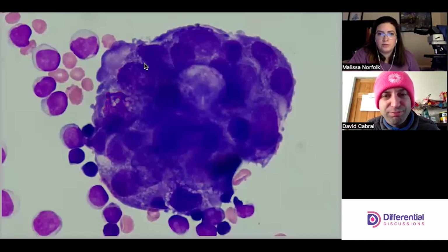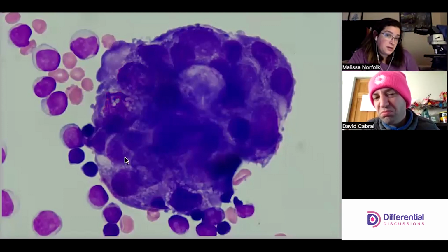Also, this first one that you pointed out is irregularly stained. Look at the colors in the cytoplasm and the nucleus itself. And then this guy over here, this giant blobbiness, I can't really tell where it begins and ends, but again, we have irregular staining patterns here.